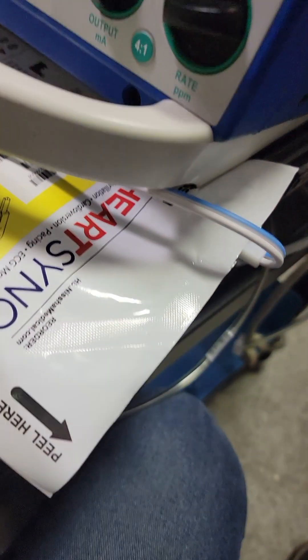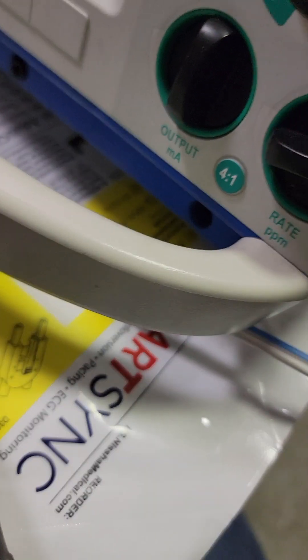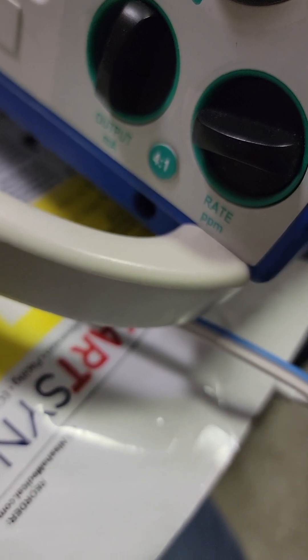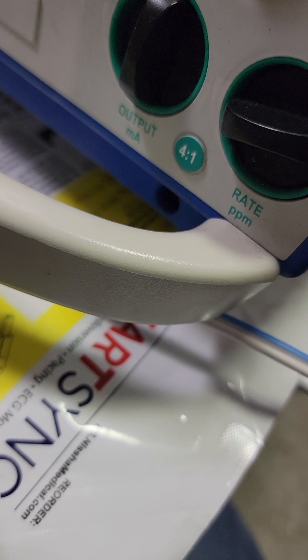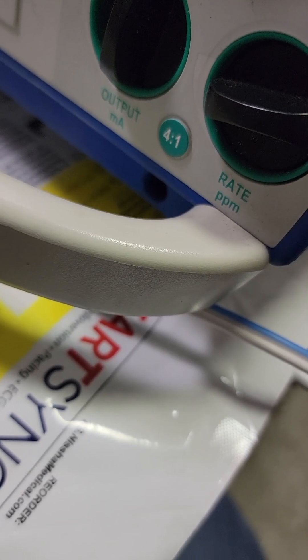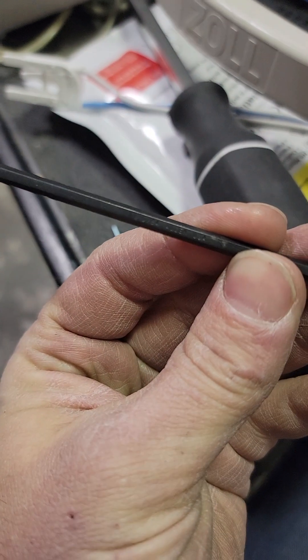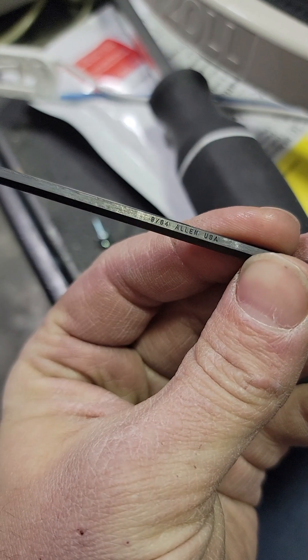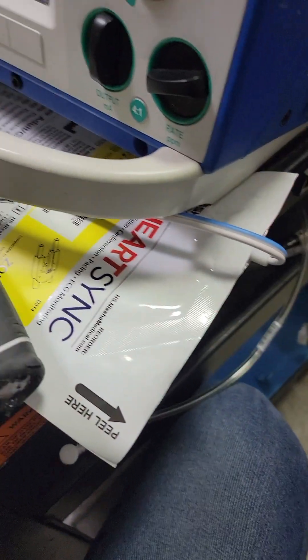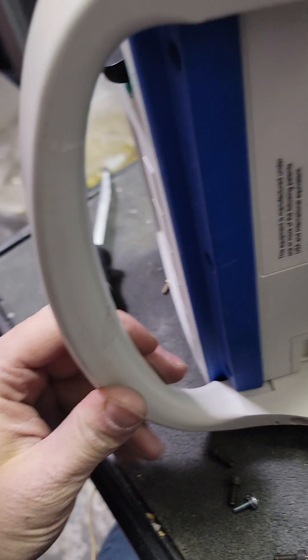Now, from there, you've got these three hex cap screws in the front and these take a 9/64th. Now, you're also going to have to remove this handle if you have one, just because you can't bend this down enough to get it out.